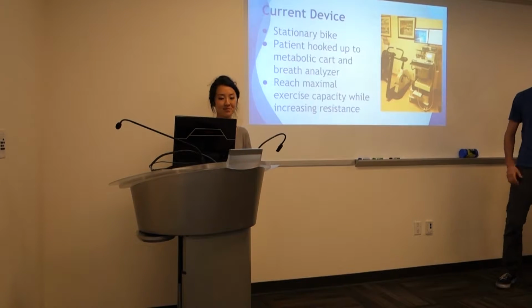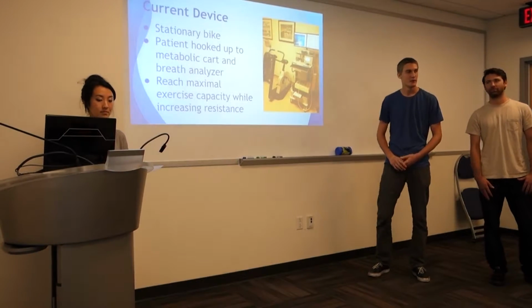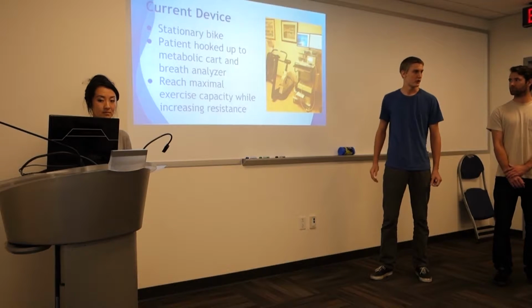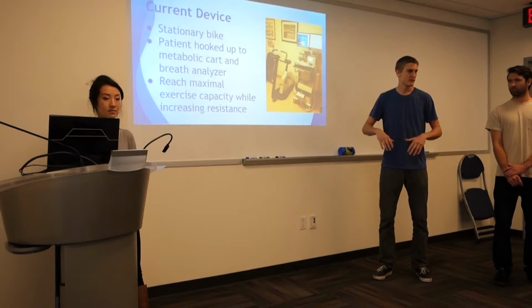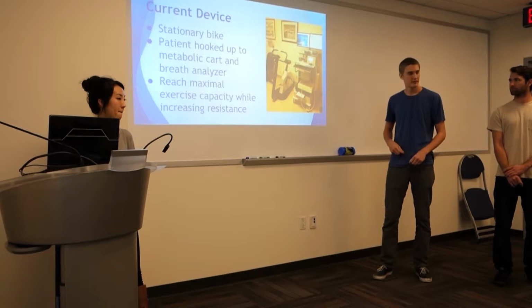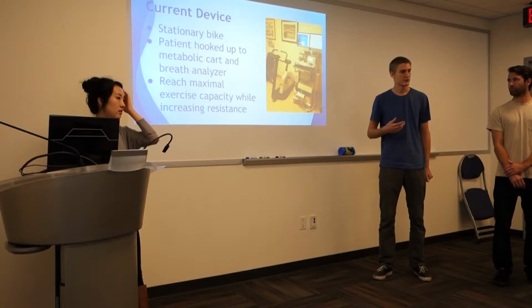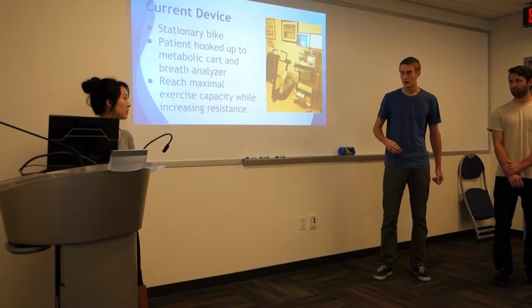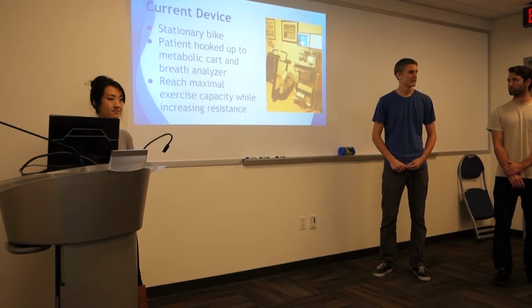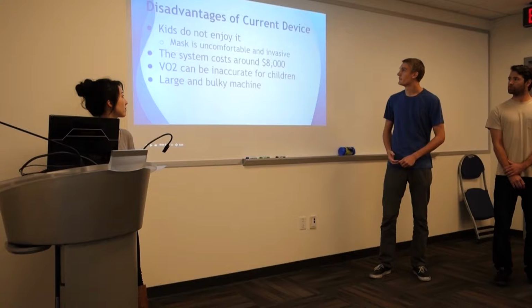Okay, so the current device that they use, not in the clinic right now because it's too large to use in the clinic, but to measure fitness in everyone, is a stationary bike setup with a metabolic cart. The patient sits on the bike, puts a heart rate strap across their chest with the heart rate monitor watch, and they start pedaling and increase resistance and how hard they're working until they reach their maximum capacity. All the while they're wearing a breath analyzing face mask, because they're trying to do a VO2 max test. That's what they have right now, but you can see there are a lot of disadvantages to this current device.